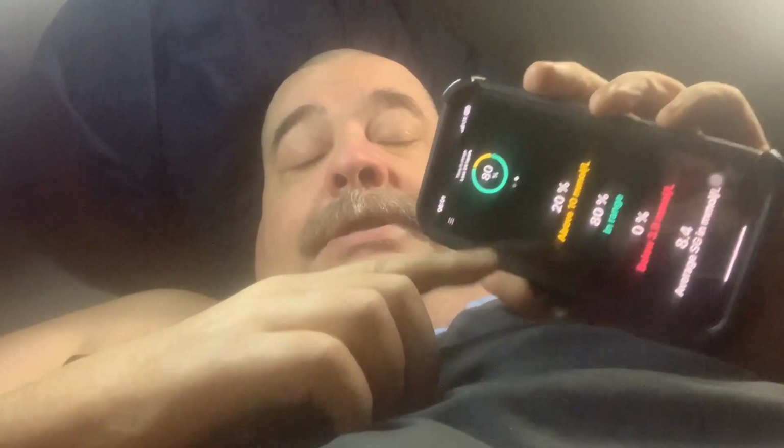I just have to order it a bit sooner and it'll get here in time and it'll be all good. I'll tell you how it goes. Just waiting on delivery, so haven't tried this before, but we'll see. But we're here talking about the CGM. The sensors themselves, once you put it in, I'll say 7 days is the limit.